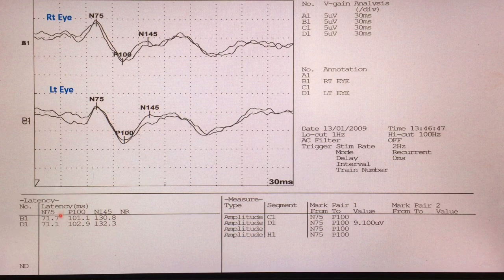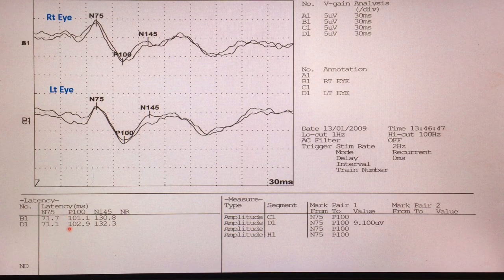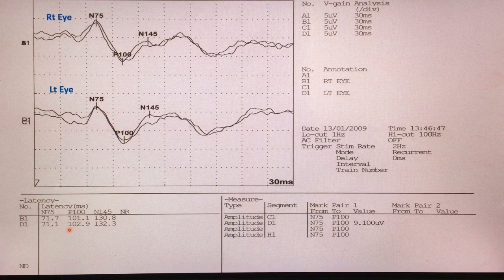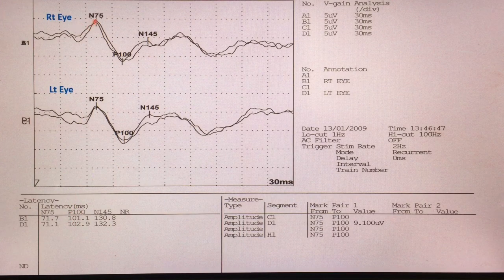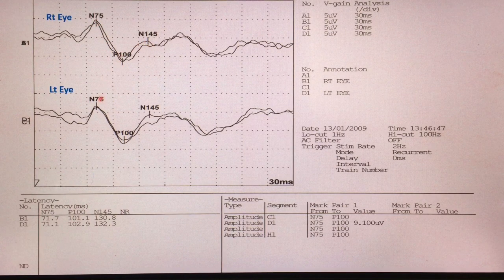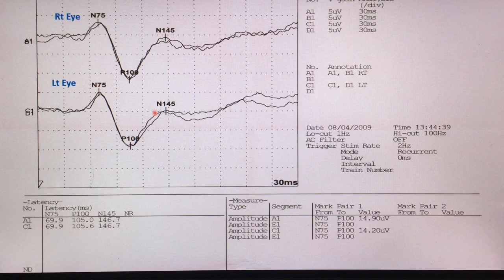Another normal well-formed visual evoked potential waveform with normal P100 latency — right side 101.1 milliseconds, left side 102.9 milliseconds. The P100 interpeak latency difference is 1.8 milliseconds. If you compare with the previous waveform, this one looks slightly different in morphology, yet still represents very well-formed visual evoked potentials with a normal NPN complex.